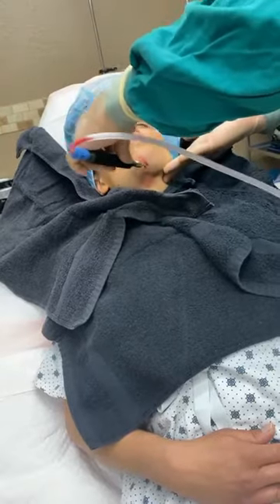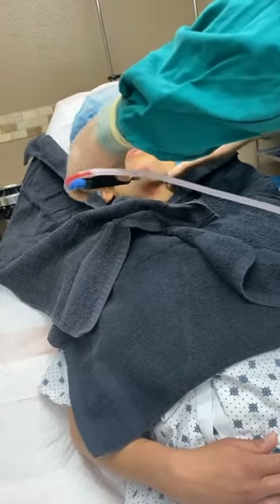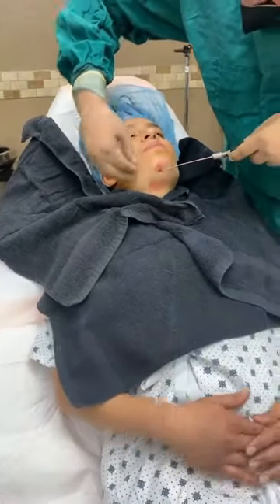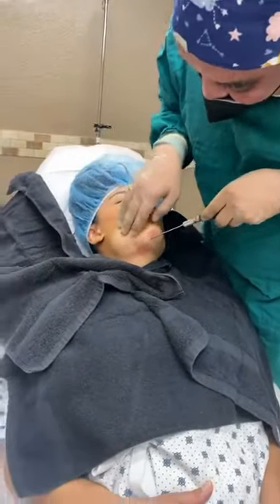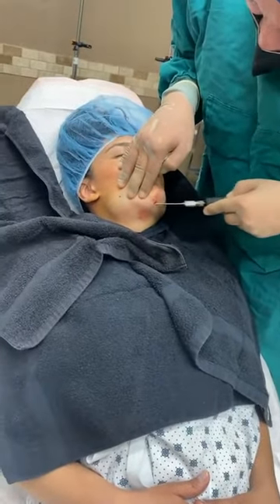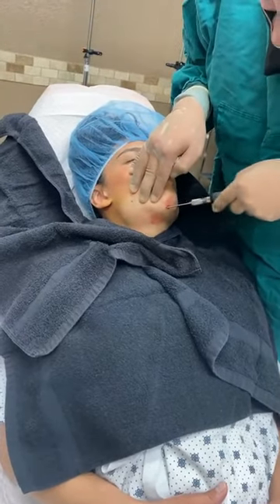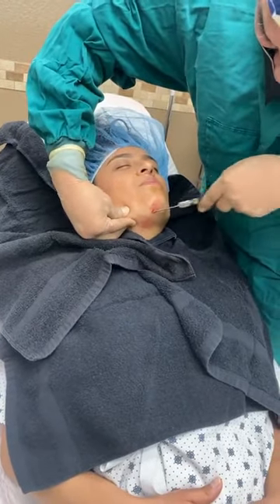You okay, the pain? I don't feel it. You don't feel it? Pressure? Yeah. I'm trying to develop that corner jawline. And that's the great thing about the patient talking to you, is that they can tell you, even though it looks perfectly fine from my end, she can tell me if it's going too far, if it's getting uncomfortable, and that's what we need to do. So I'm developing that jawline for her, grabbing underneath.